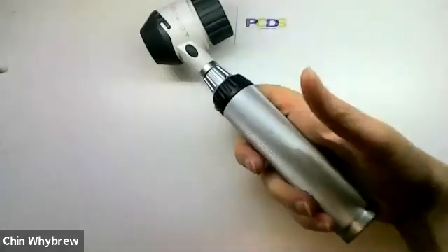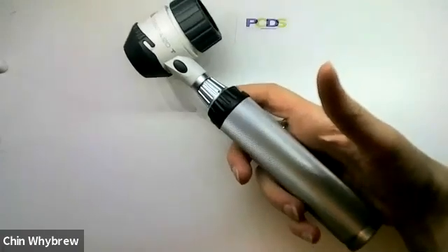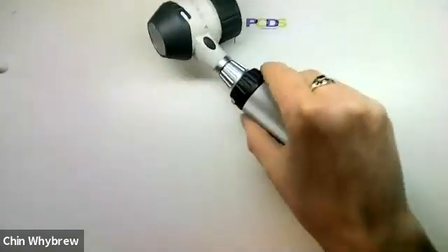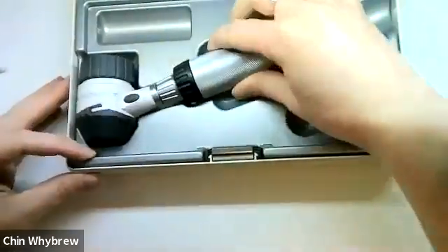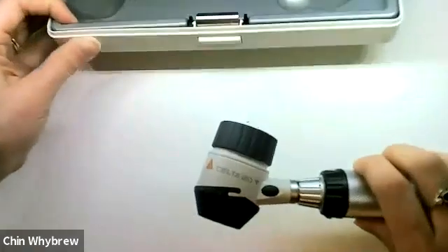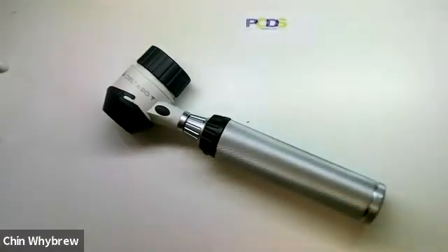Size-wise, it's very similar in size and weight to your standard otoscope and ophthalmoscope, so you could keep it in a pocket if you wanted to. It does come with a case which it fits into quite nicely, but the case is quite large and less easy to carry around in your pocket.